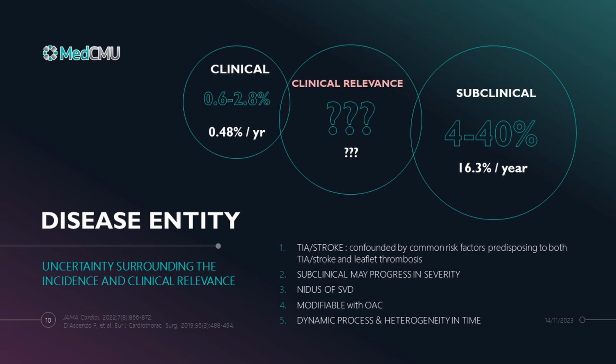And sometimes subclinical HALT may progress in severity and later become symptomatic. And the thrombosis itself can be the nidus for structural valve dysfunction in the future. This process can be modifiable with oral anticoagulation, and it also has a dynamic and heterogeneity in time.